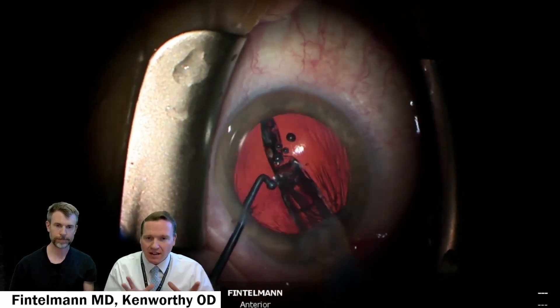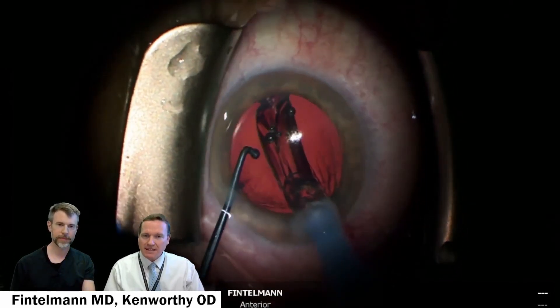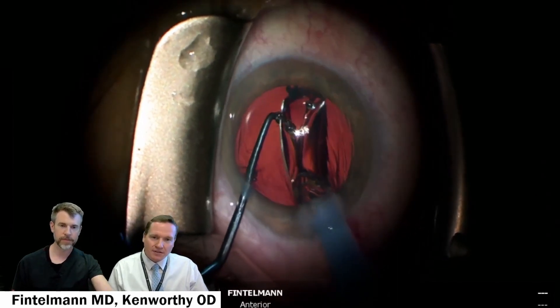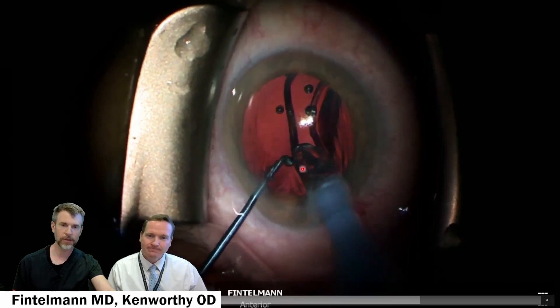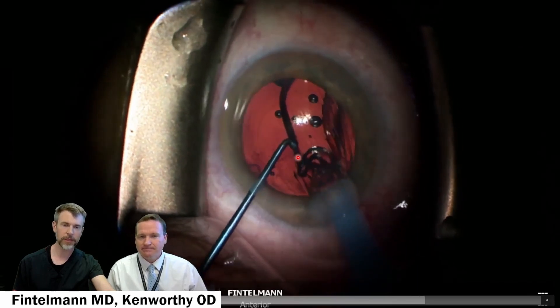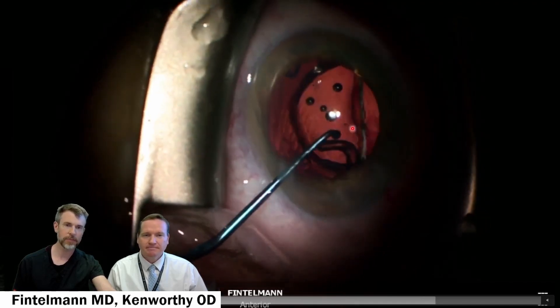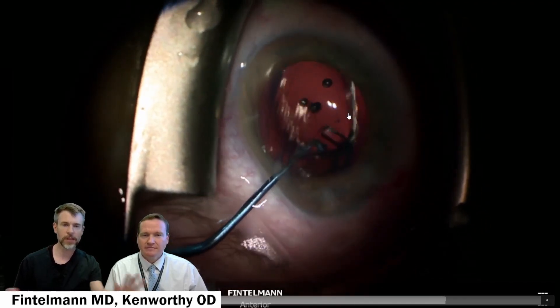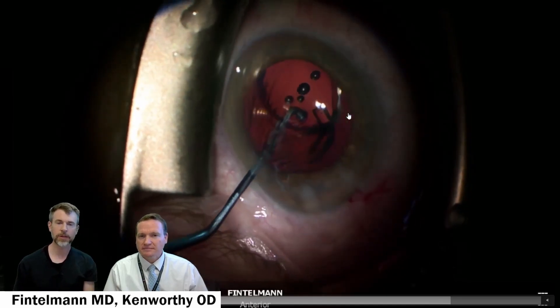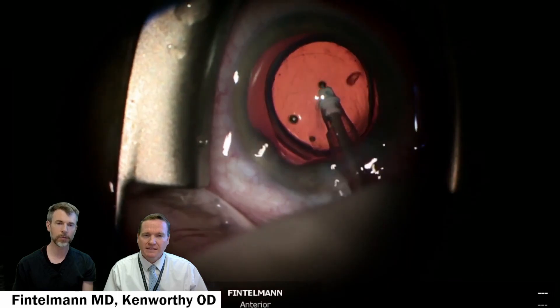And that is the lens, what we're seeing. I'll pause for a moment — take a look and tell me, is that a one-piece or a three-piece? As you see it unfold, you can tell it is a one-piece IOL. All the same color, all made out of one piece — hydrophobic acrylic. A second instrument positions the lens. This is a Zeiss lens; the haptics fold so one goes up and the other goes down, a little different than others, but it unfolds nicely and goes into the capsular bag where it's supposed to be.